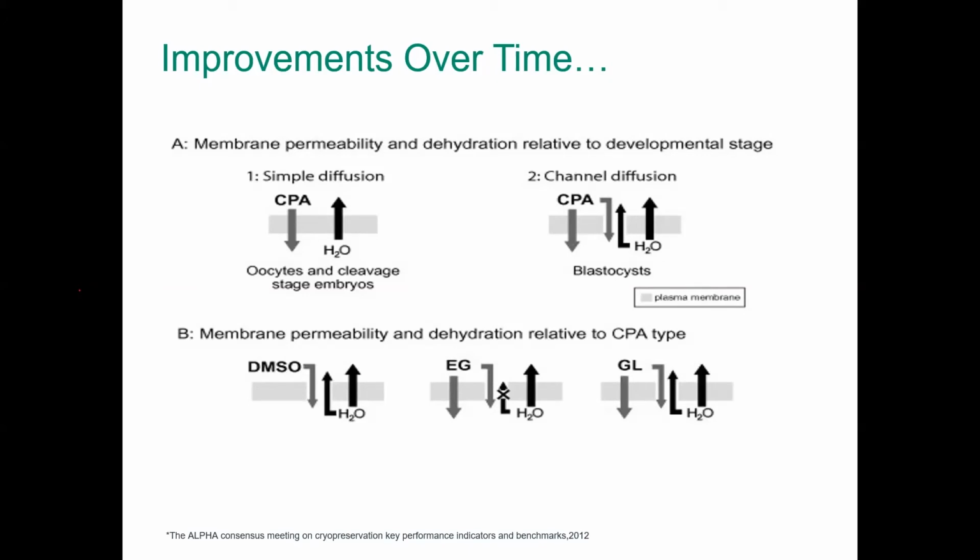So all this needs to be understood well, to know how to expose the cells to the cryoprotectant while appreciating time, temperature and concentration at the same time. So again, the aim is to have the permeating cryoprotectant replace the intracellular water with the minimal effect of toxicity.